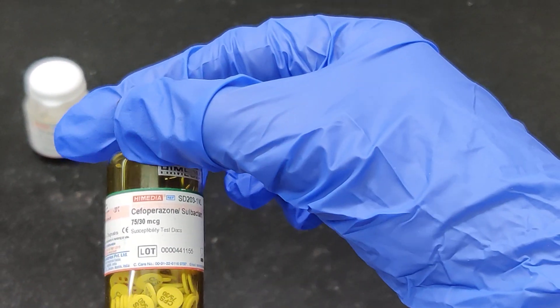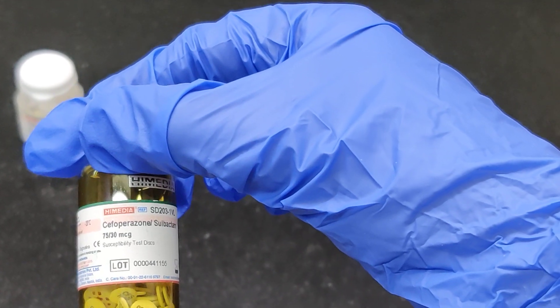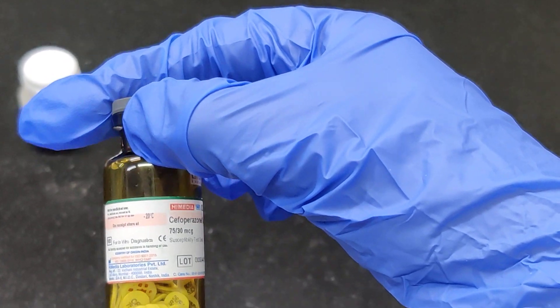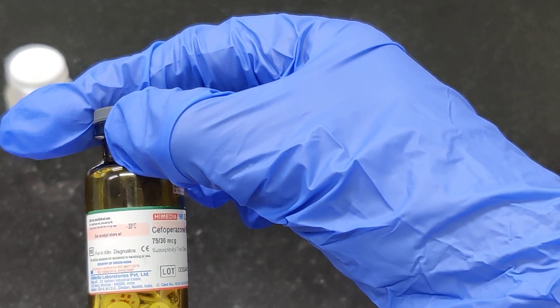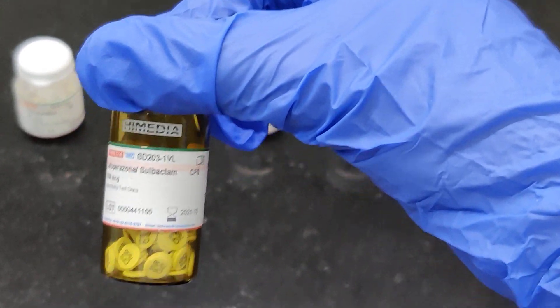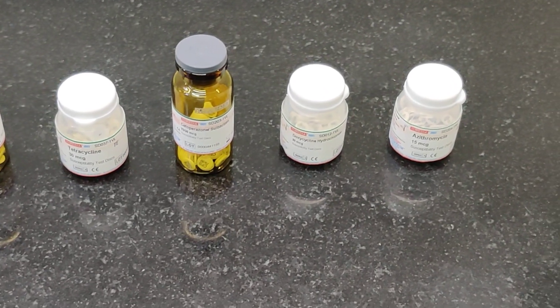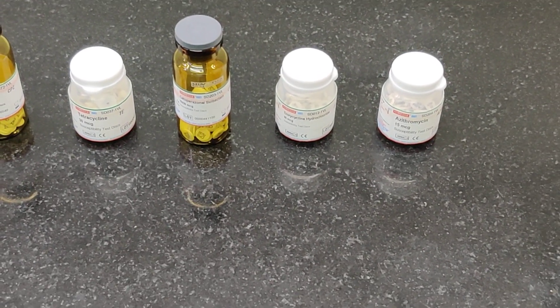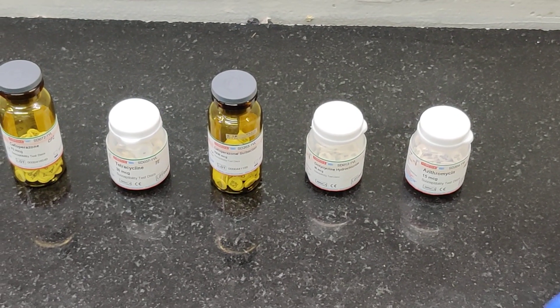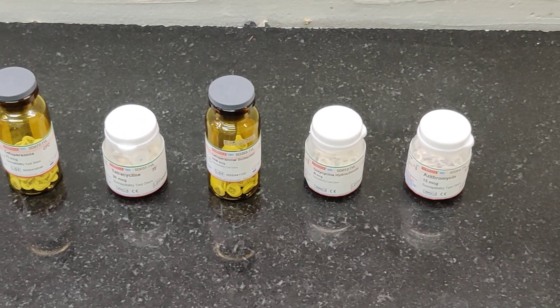Once these discs are purchased, they have to be stored at minus 20 degrees Celsius, but the working stock can be kept at 2 to 8 degrees Celsius. We are going to refrigerate these discs when we buy them, and it's very important that for the daily purpose of AST procedure by the disc diffusion test, you have to get these discs out of the refrigerator at least one hour prior to carrying out the disc diffusion method.